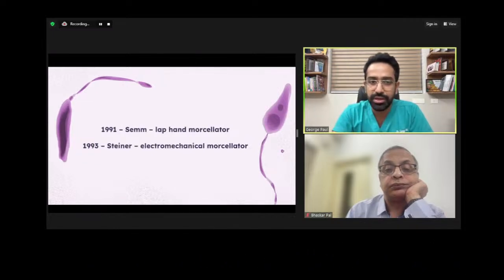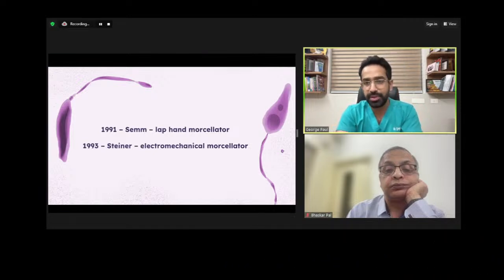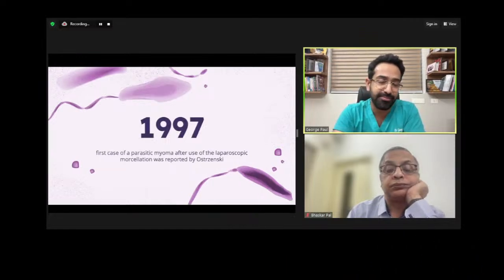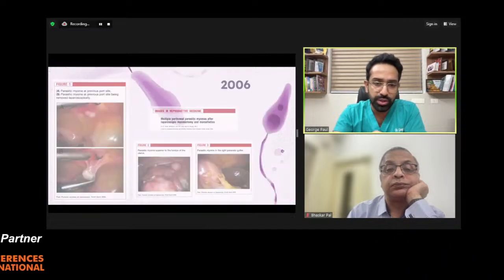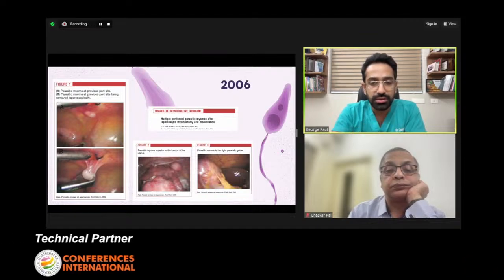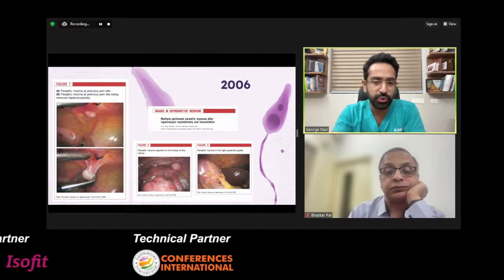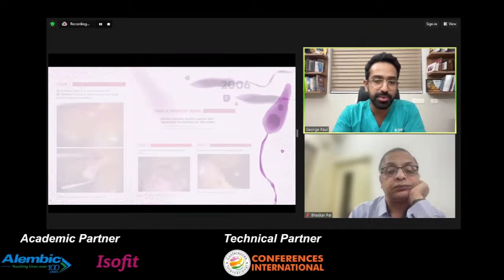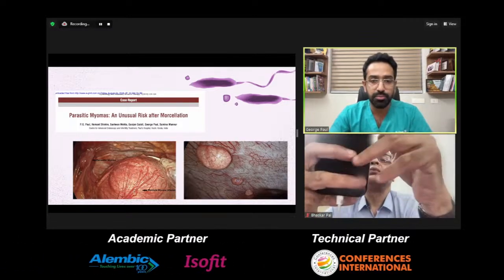By 1991 is when Semm developed the laparoscopic hand morcellator. By 1993, electromechanical morcellators came into the market. And soon after, by 1997, is the first case of parasitic myoma recorded in the literature by Ostrzenski. Within a few years, even we faced some parasitic myomas. This was an image article that we published in 2006 in Fertility and Sterility. But in fact, the actual surgery was a few years earlier, I think it was the early 2000s. So the incidence of parasitic myomas has been on the rise from the beginning itself. And as we've been doing more and more cases, we've seen more parasitic myomas.